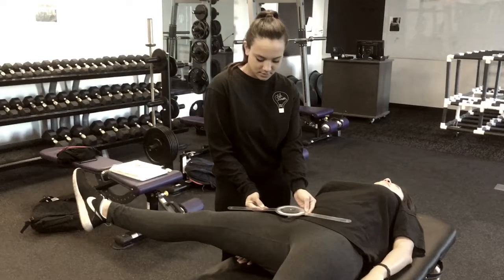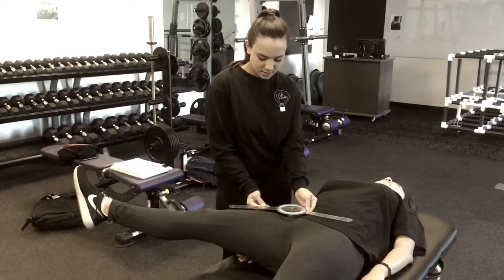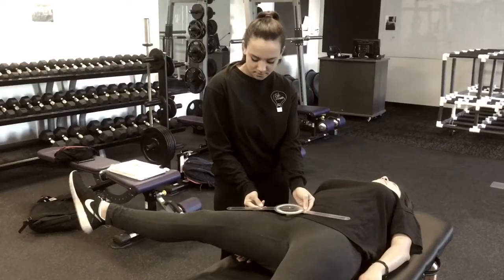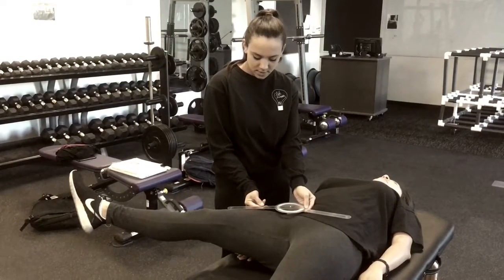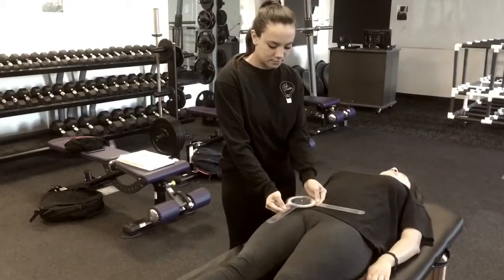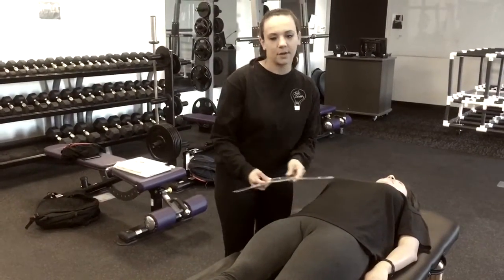The stationary arm is placed along an imaginary horizontal line that extends from one ASIS to the other, and the mobile arm is aligned with the midline of the femur. Normal range of motion of hip abduction is 45 degrees. Specifically shown in this video, the client received 40 degrees.